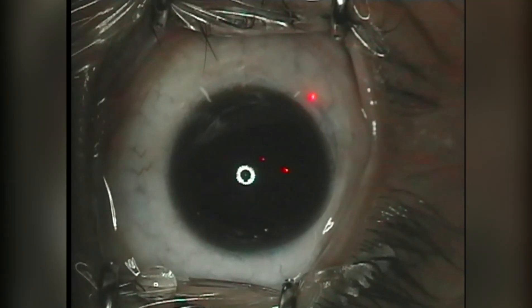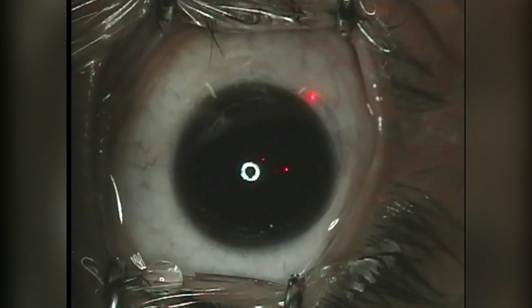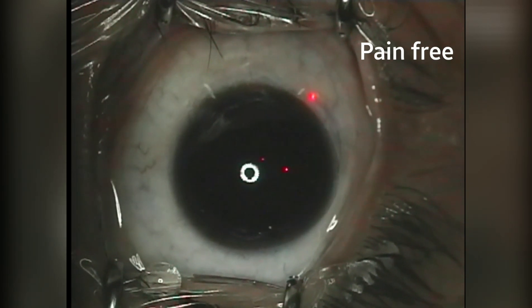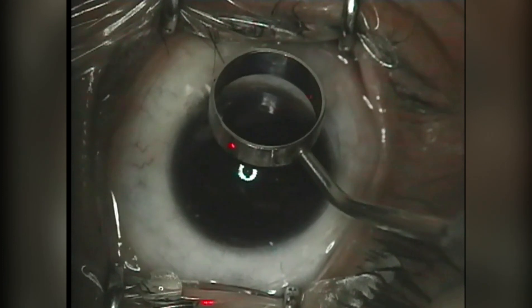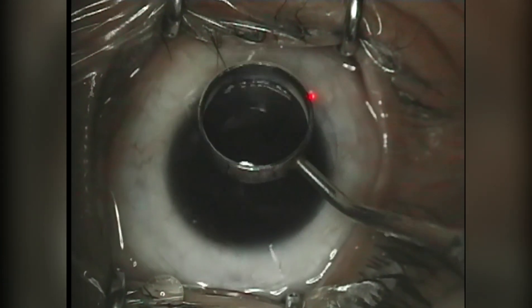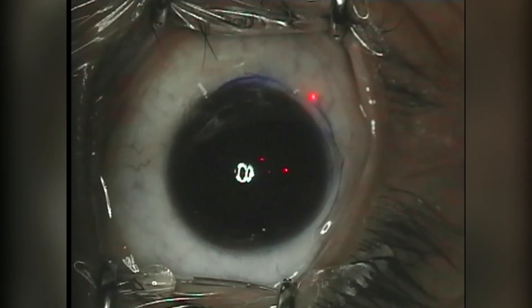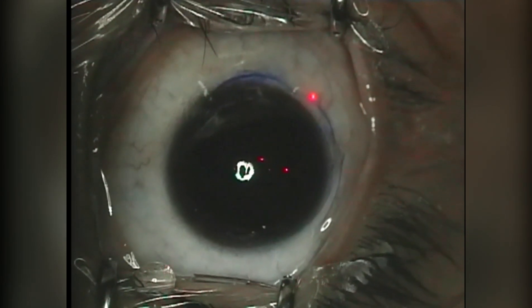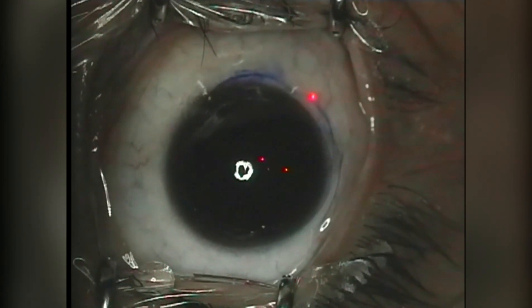Now let's watch the actual video. First, the doctor numbs the eye using anesthetic drops. LASIK surgery is essentially pain-free and it takes only about 15 minutes to complete for both eyes. The doctor then places colored markings on the cornea to guide realignment after laser treatment. We will later see that a flap on the cornea is made and displaced for a few seconds to expose the corneal bed.